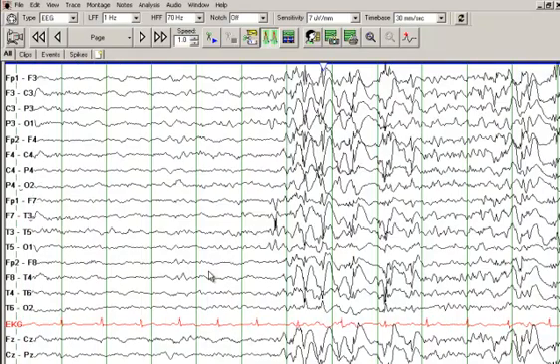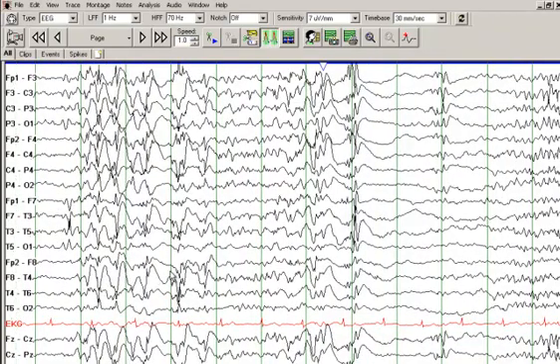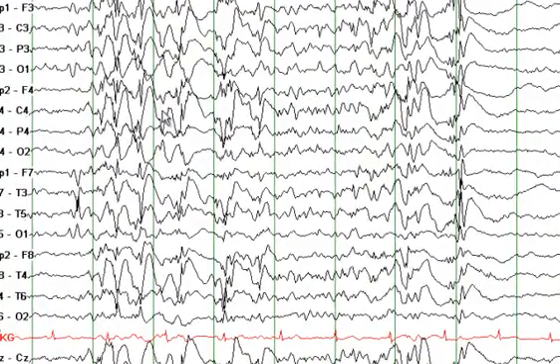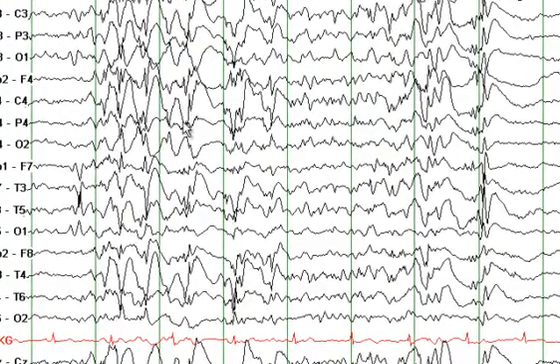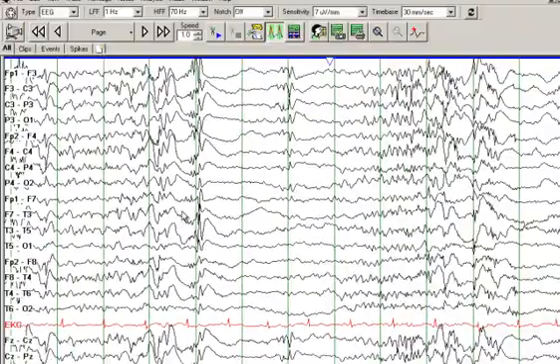We see another sharp wave here, and slow spike-and-wave discharges. Looking at the frequency, it is not very well organized — you see this slow activity with sharp waves that precede it.